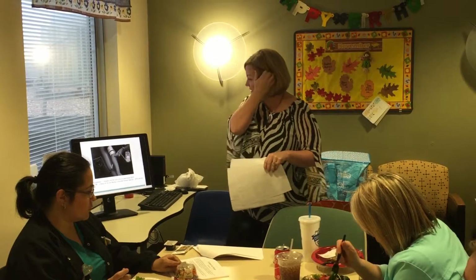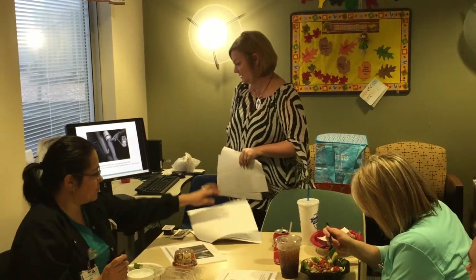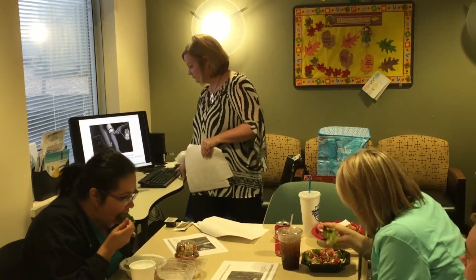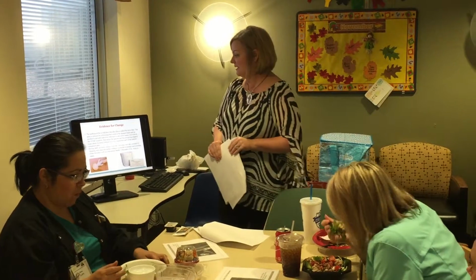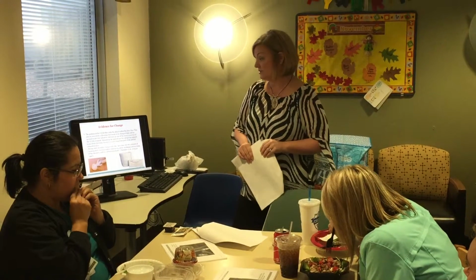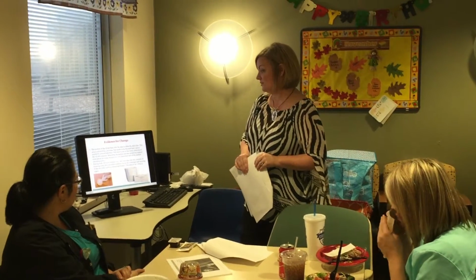So this is just a picture of a patient getting their MAP taken with the Doppler and the blood pressure cuff. So another big concern for LVAD patients is the risk of infection I mentioned earlier. So we're pretty familiar with cleaning wound sites with chlorhexidine. So that's pretty much how it's done as well.